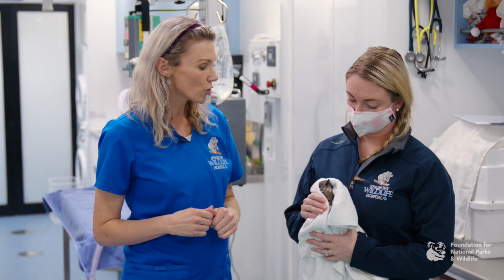Just be aware with some of your seabirds, especially those ones that are diving for their fish, will have a really prominent diving reflex and can hold their breath for prolonged periods of time. This may affect your anaesthetic induction, and this is something that you need to be aware of and monitor as you're inducing them. So we're now going to anaesthetize Effie. I'm also going to show you a very important part of their anatomy that you have to be aware of when you are intubating a seabird.